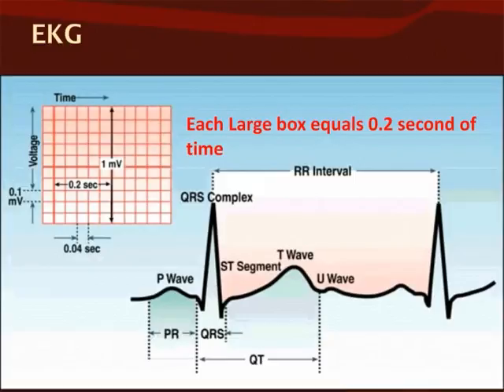So that's why I've been emphasizing normal conduction pathway, so that when you look at an ECG pattern or a waveform, and you see that it looks like what we consider to be normal sinus rhythm, then you know the heart has taken this normal pathway. However, if it looks bizarre, then we know that the impulse was rerouted somewhere.